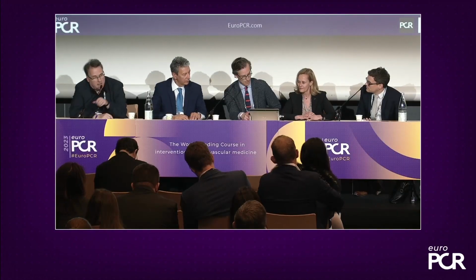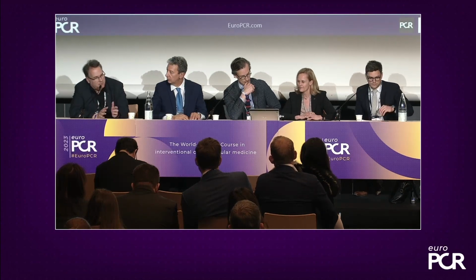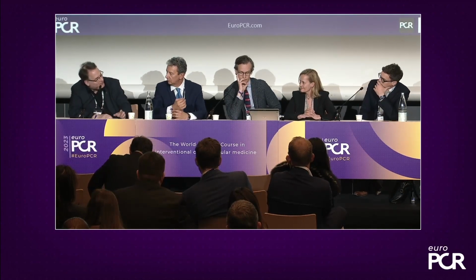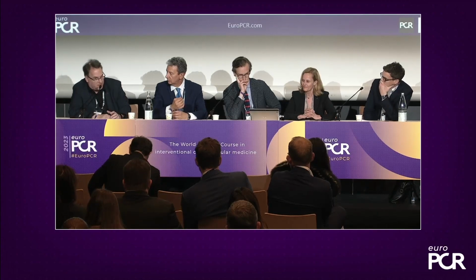Stefan, do you see? I totally agree. I think it also depends on the anatomy. I think the more you're left-sided, the more you're TAVR or mitral, the more you will use TOE, to be honest. The reason why this is used differentially is that you want to overcome the situation where you have no image, like on TOE. In the past, we said we moved to TTE images, but this is very inferior. Now we do them all with TOE, but sometimes you don't get the crispiness.